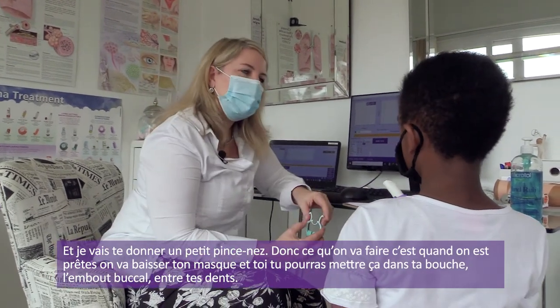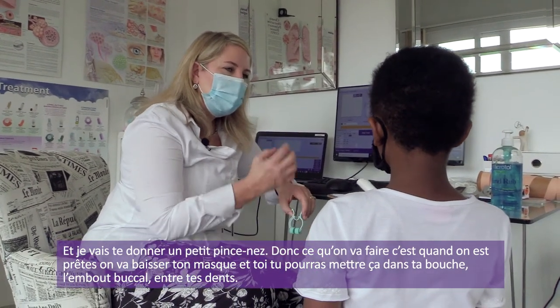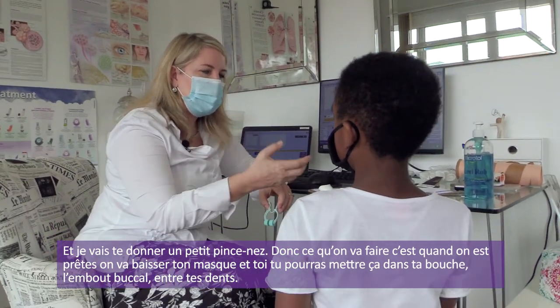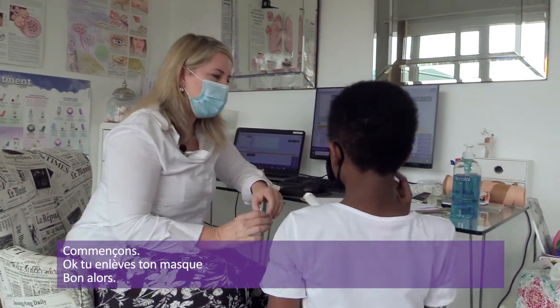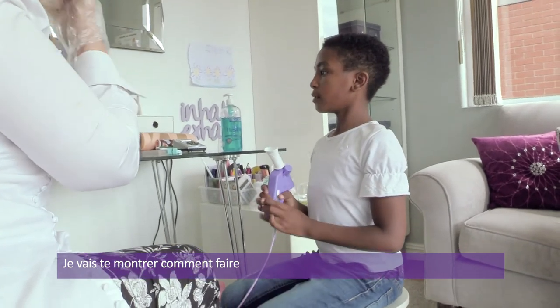So what's going to happen is when we're ready to start the blow, we're going to take your mask down, and then you're going to bite your teeth over this mouthpiece. So let's just start. You can take your mask off. Okay, so what you're going to do, I'm going to show you how to do it.